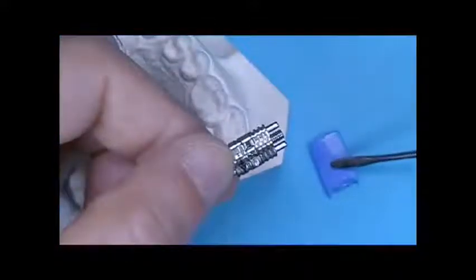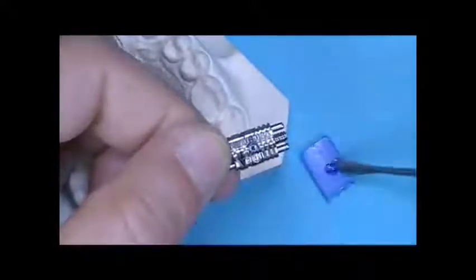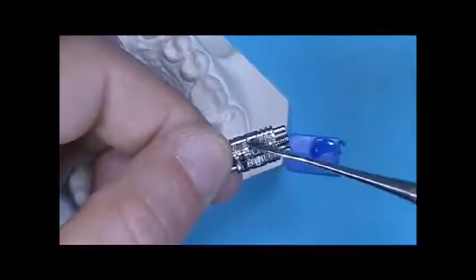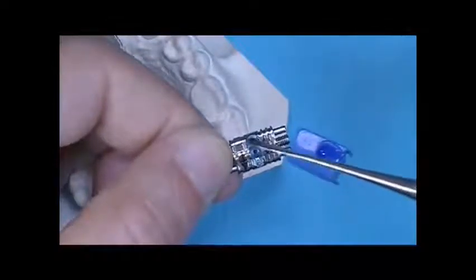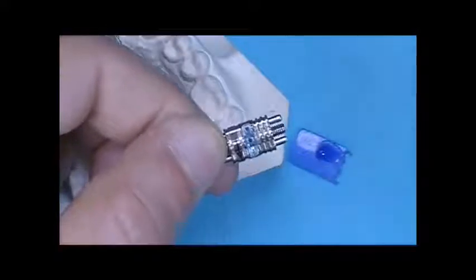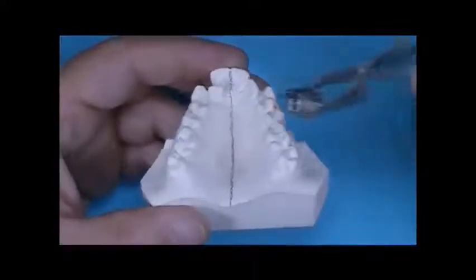With a hot wax spatula, apply wax over the active area of expansion screw. This will prevent acrylic from entering keyhole port. The separation of screw or center opening is to be parallel to the mid-palatal reference. Also, the threaded middle post protruding laterally is positioned near the second bicuspid region.